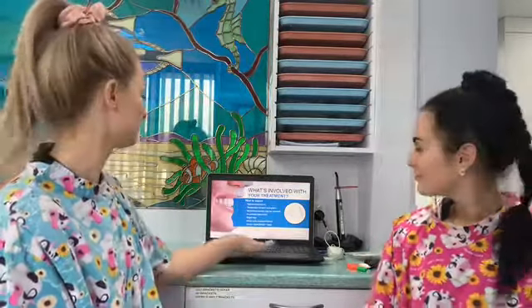If you feel like you're getting any ulcers, we have some brace relief gel, and all you need to do is put a little bit on your finger and rub it into the ulcer. This will numb it for 20 minutes, and it also just helps it heal a little bit quicker because it has an antiseptic base in it.